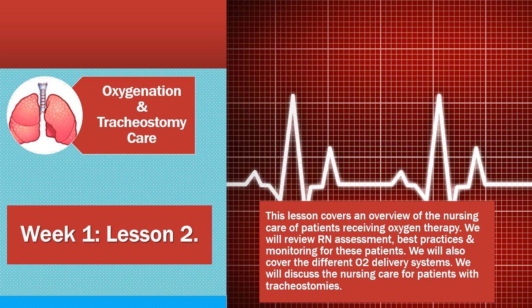O2 therapy is going to be prescribed when the needs of the patient cannot be met by room air alone, the 21%. You want to apply oxygen to anyone who is hypoxic. You want to make sure that the therapy delivered to the patient is humidified appropriately. And the goal of therapy for oxygenation is that we use the lowest fraction of inspired oxygen, which is called FiO2, to have acceptable blood levels without causing any harmful side effects.